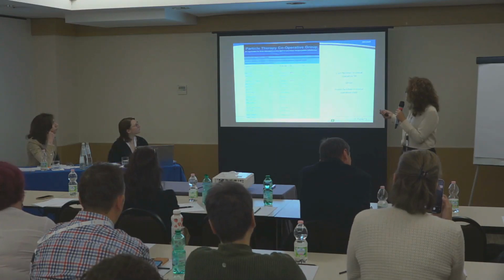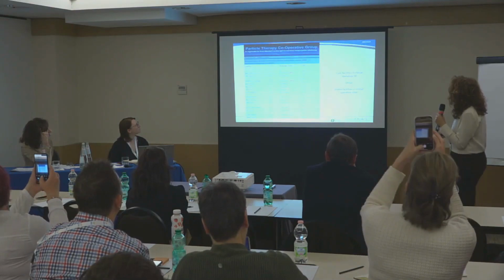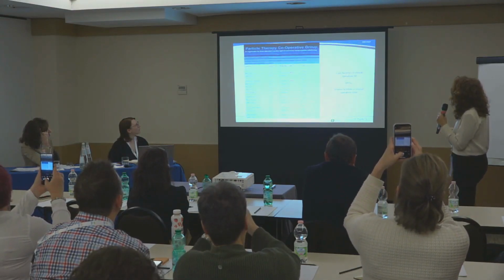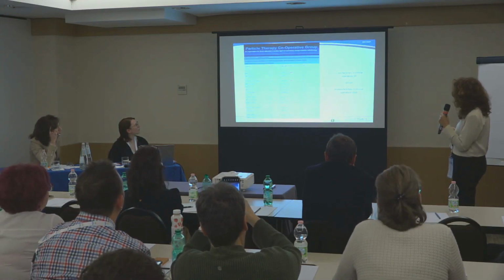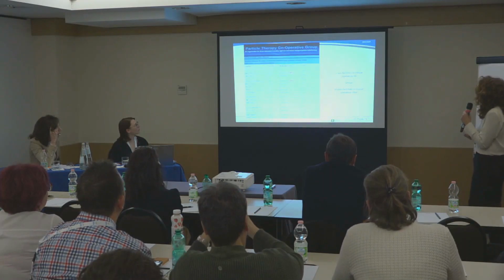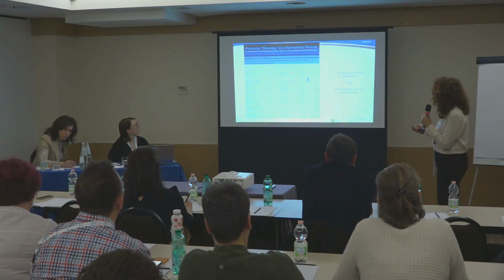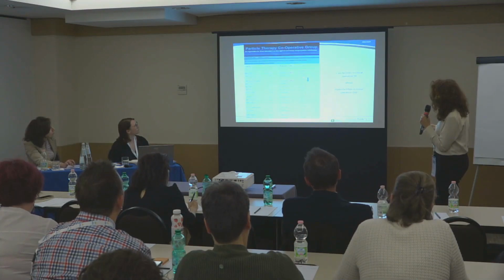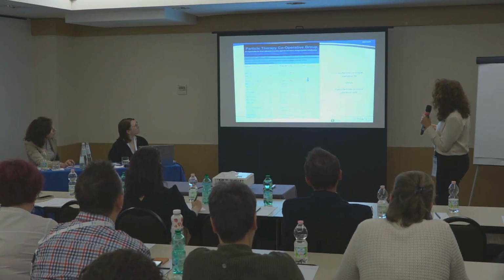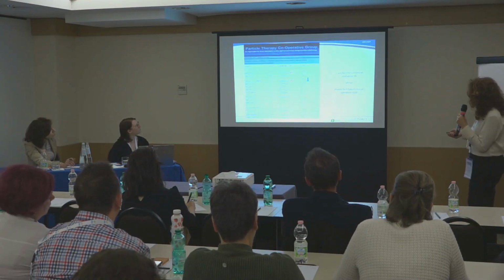This is the most recent list from the Particle Therapy Cooperative Group. You can see we have only 14 carbon ion facilities in clinical operation versus more than 100 proton facilities in clinical operation. And I want to point out that from 2009 we started to have more facilities with carbon ion beams.